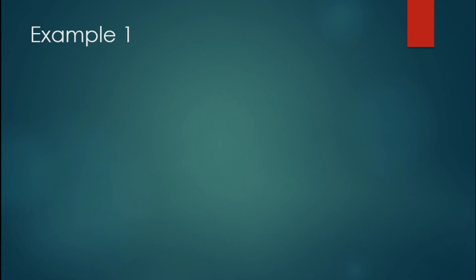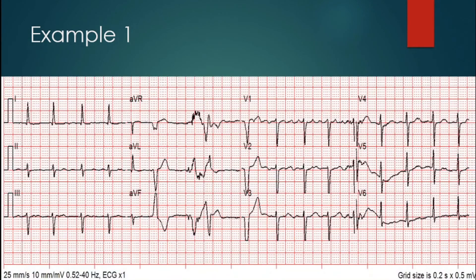Now let's look at the first example. Look at V1 — you see all that atrial activity right there? Those are your hidden flutter waves. The rate you can see here is around 300 beats per minute. If you look at the rest of the 12-lead, you won't really see any perfect flutter waves anywhere.